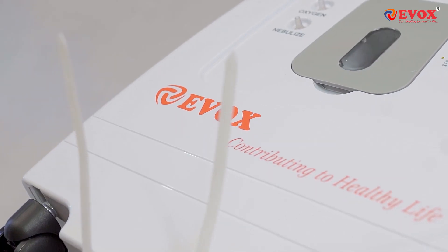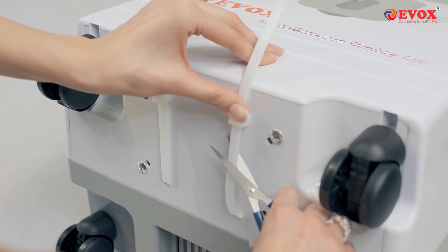Before using the Evox Oxygen Concentrator, make sure you cut through the compressor safety locks.